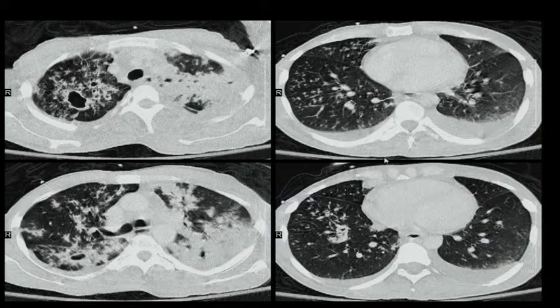Cavitary lesions. Number two, something very, very unique to TB. Not very unique, but tree-in-bud opacities. Okay? Sarcoid, TB, granulomatous diseases. These are called tree-in-bud. What does tree-in-bud opacity show us, Noor? It would be like an infectious process that spreads through the small airways. Correct. So it is just the same thing, finger in glove of the small airways.